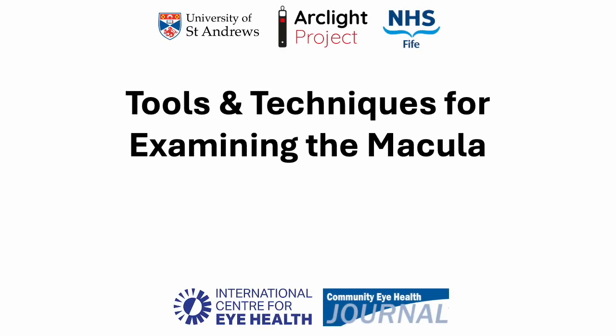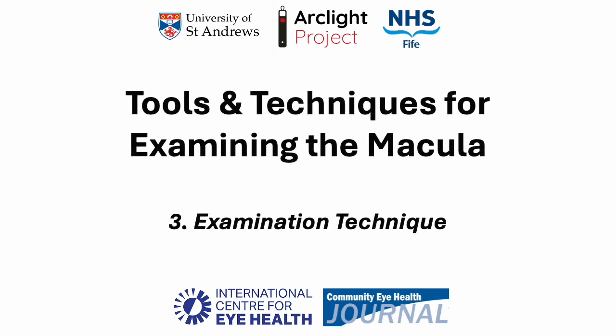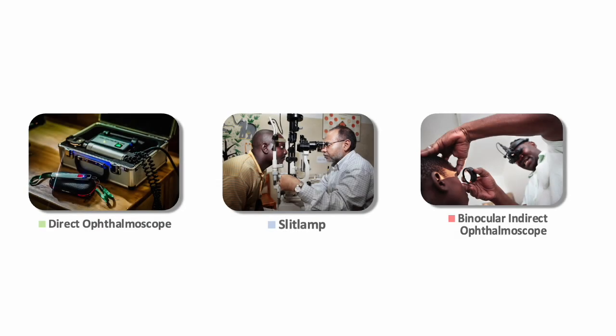Tools and techniques for examining the macula. Examination techniques. There are a number of general tips for performing ophthalmoscopy of the macula that apply to the three different tools.